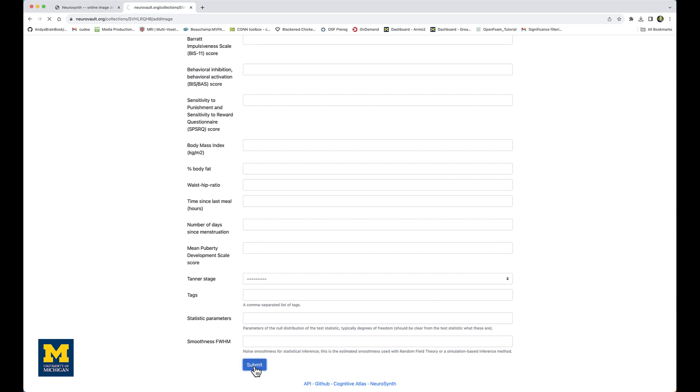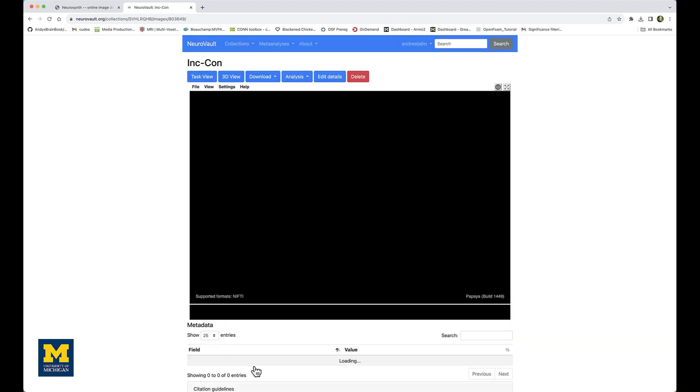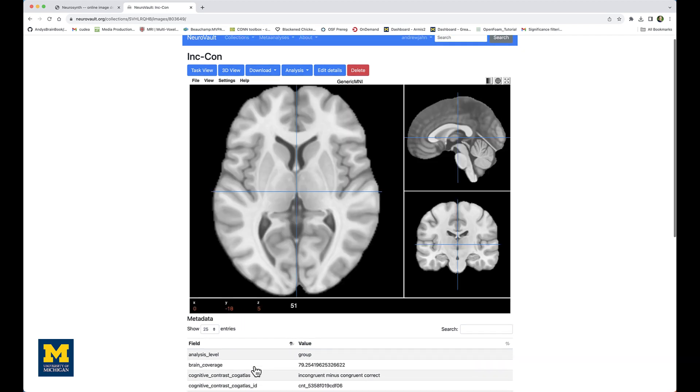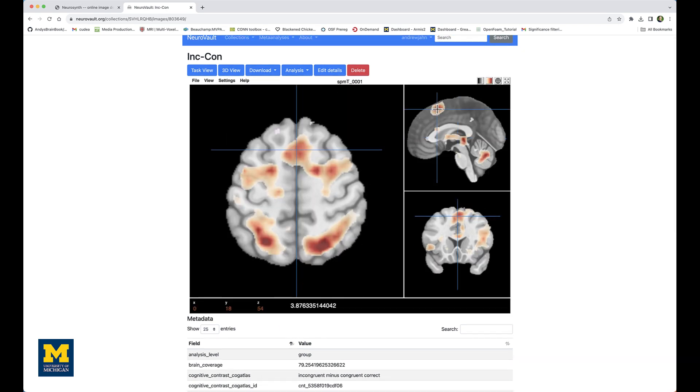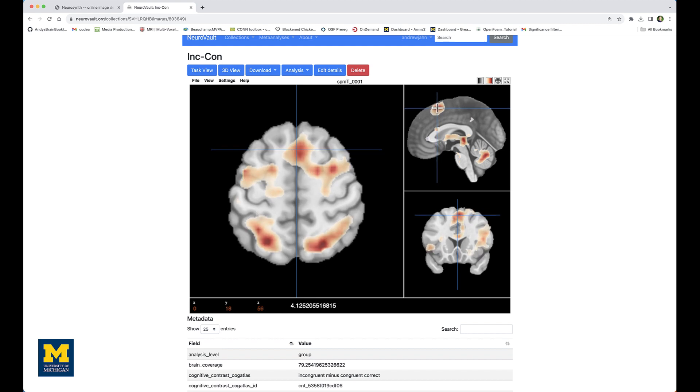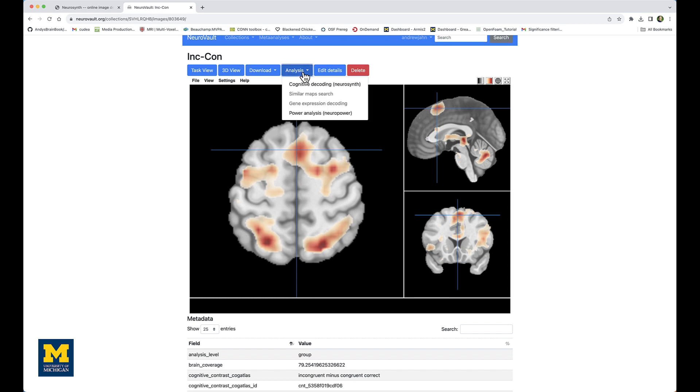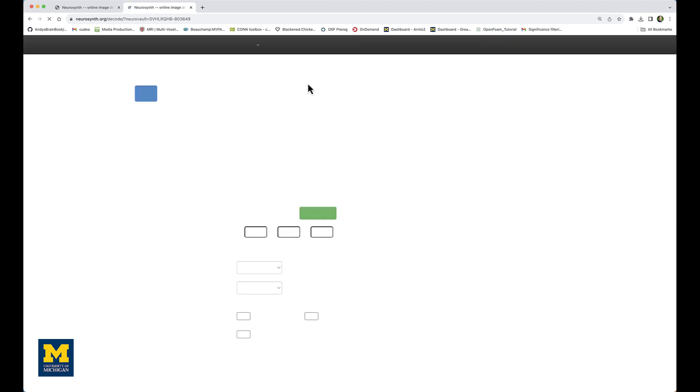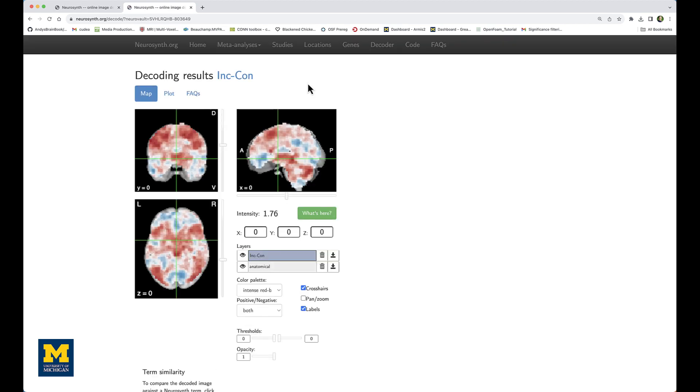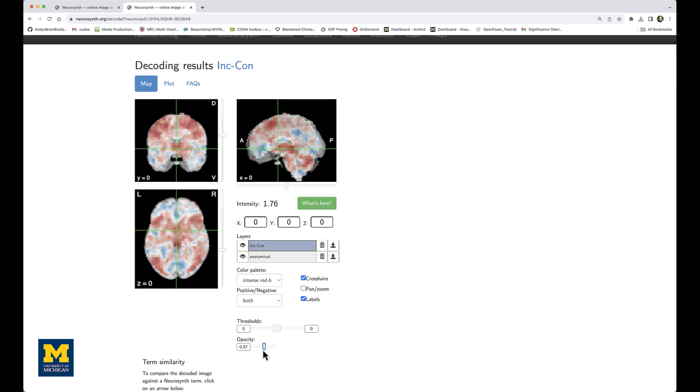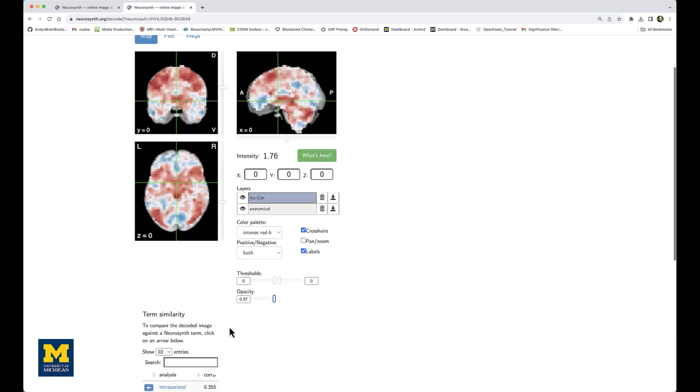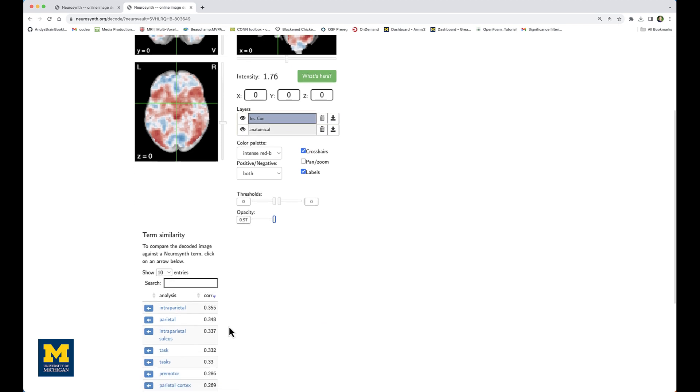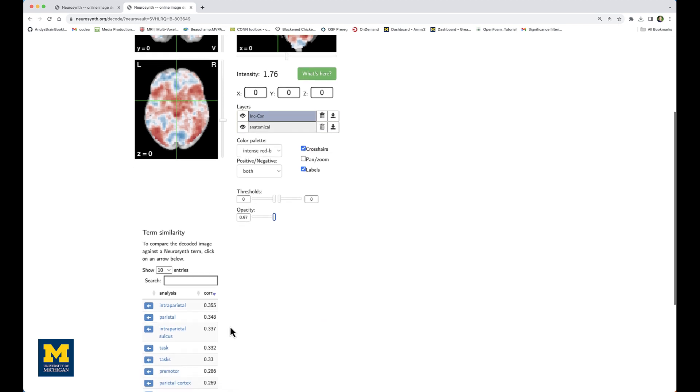This will load your image in the Papaya viewer, just like we saw with the other Neurovault images. And here you can see that I have effects in the pre-SMA area. Now I'm going to click on Analysis, Cognitive Decoding Neurosynth, which again takes me to the Neurosynth page with this contrast file uploaded. Now, as before, I can toggle the opacity, see where exactly on the template brain my effects are.